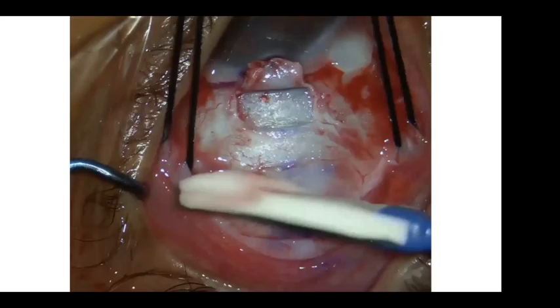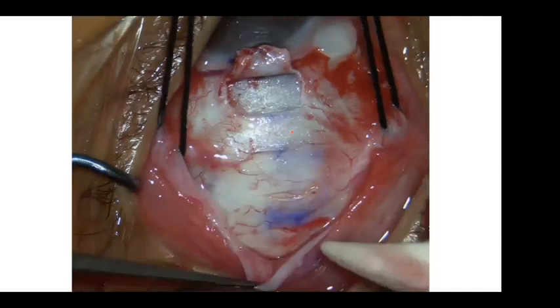And then the third part is a flap. I dissect a flap like that after trabeculectomy. And definitely I'm just presenting what I'm doing. I know there are hundreds of modifications, and definitely I have experts with me, Dr. Ali, Dr. Hassan, Dr. Mazen, and lots of glaucoma surgeons. They have their own tricks, but I'm just showing what I'm doing in reality. And then the sclera flap, it's better to be a thick flap. It's different from the deep sclerectomy, which is a thin flap. I like to go for a thick sclera flap.